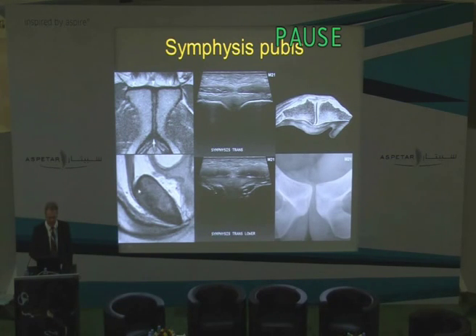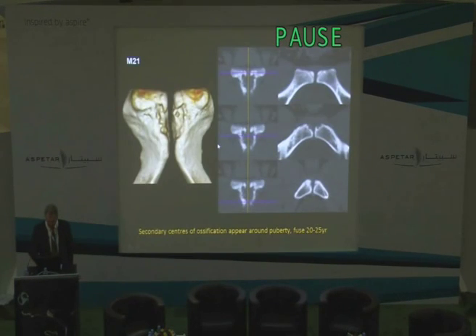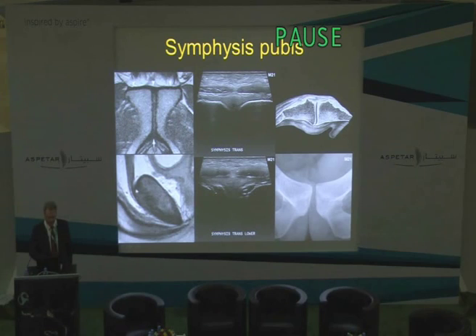Now, the anterior pubic ligament is a very thick structure. You see it over here in this anatomical drawing, and as has been mentioned earlier today, it is a layered structure. And we do, in fact, routinely resolve these layers on both ultrasound and MRI. On MRI, sagittally here, notice this slightly hyperintense zone within the anterior pubic ligament. This is a very important structure, which I'll come back to soon.